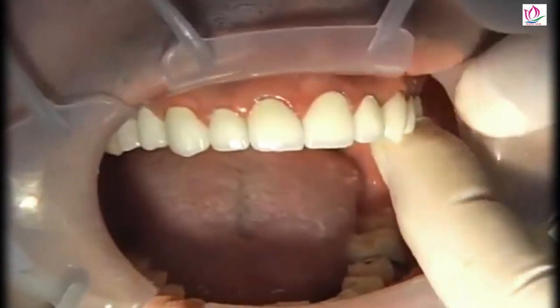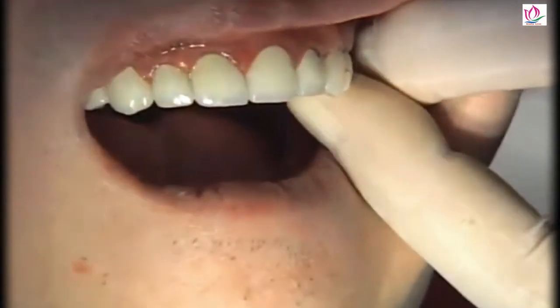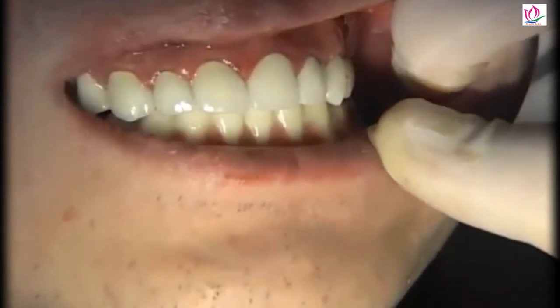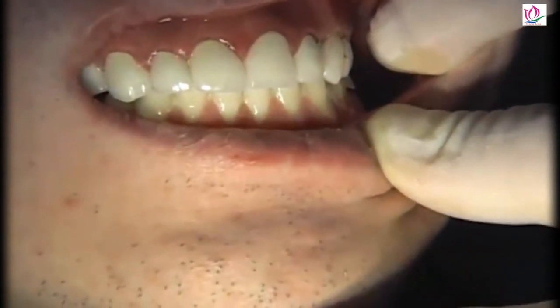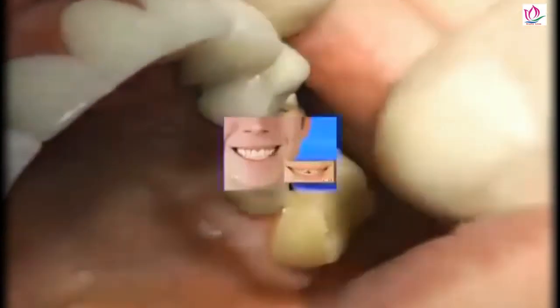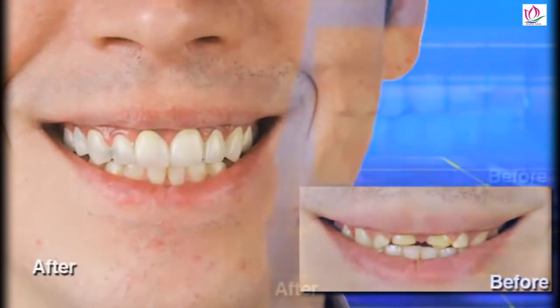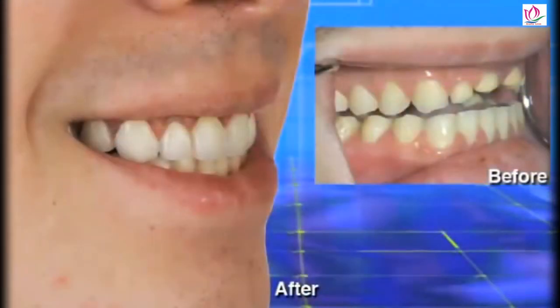We place the last unit and have the patient bite together one more time to verify everything's still in maximum intercuspation. We run floss in between and clean things up. You can see the after with the cap-tech crowns in place — it's certainly a huge change from what the patient had before. He was one of those patients who would actually cover his mouth with his hand when he smiled, very embarrassed about the look of those front teeth. And you can see on the after how he smiled.